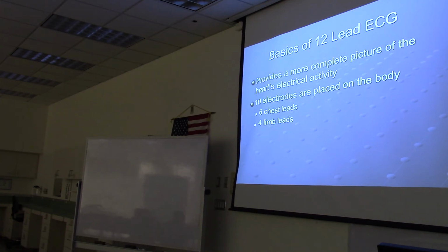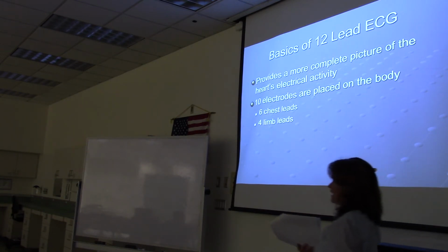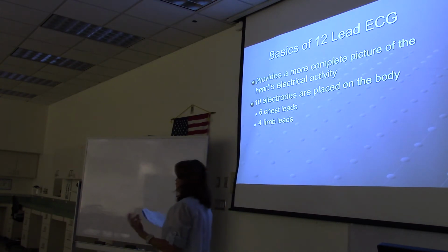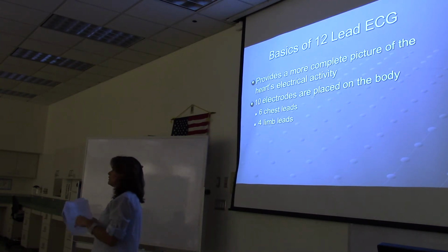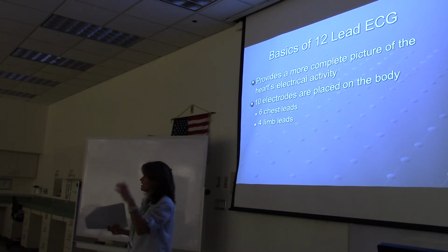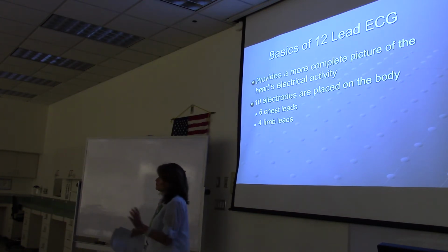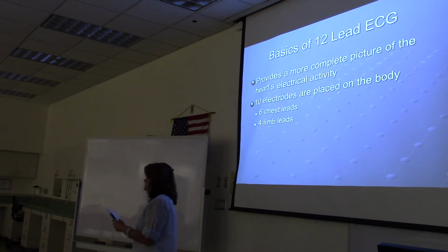All right, with 12-lead EKG, respiratory is, in some hospitals, responsible for running 12-lead EKGs. And the machines that you use, you get trained on, and they're pretty simple, and every machine is different. So we don't have any in the lab for you to practice on. So you will be trained at the hospital that you're working at with the EKG machine that you're working with. But attaching the leads is universal. So we're going to go through how you would attach the leads.